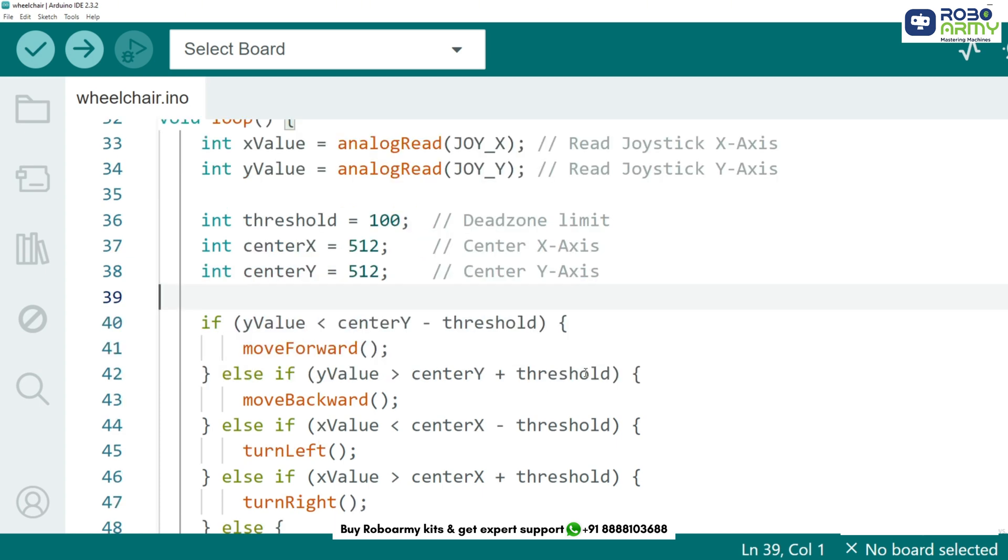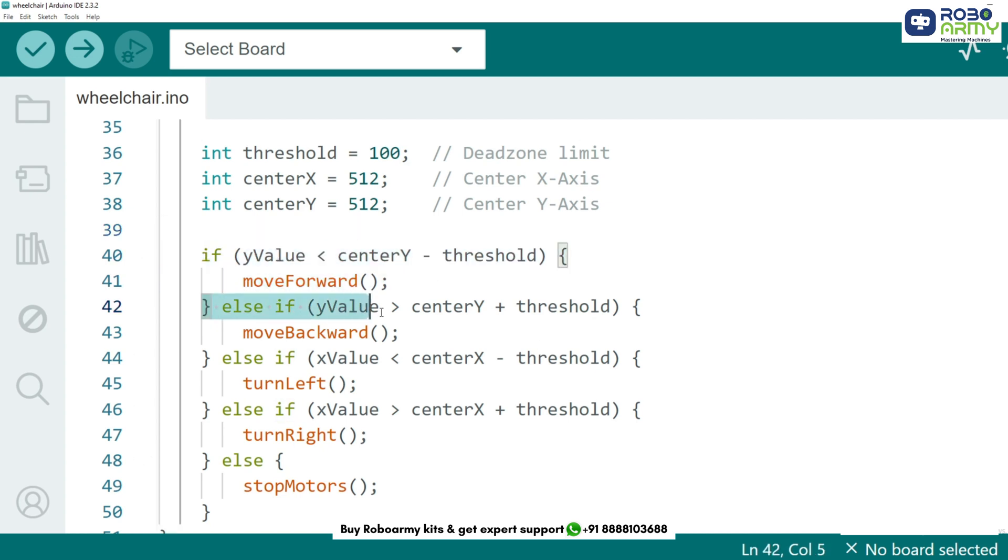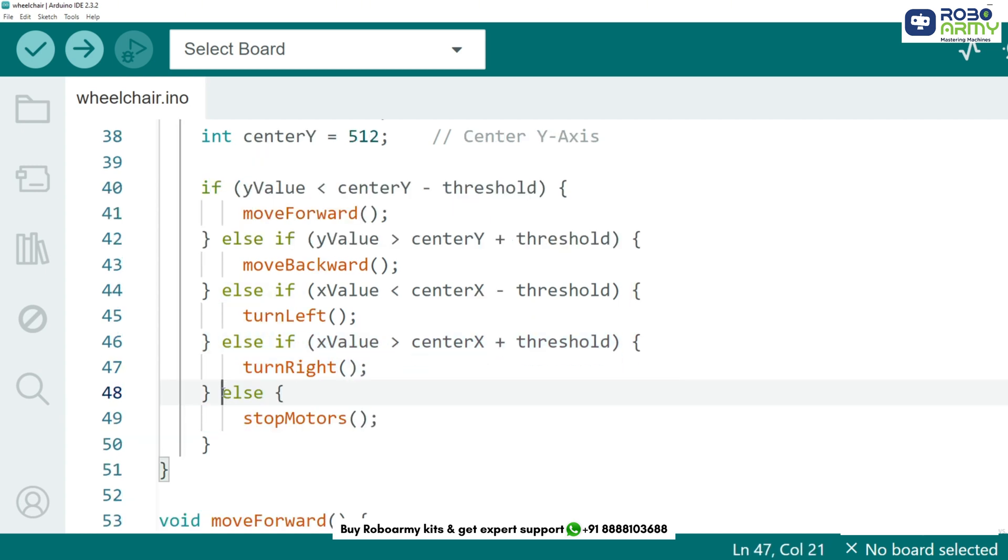Now we check the joystick position and control the motors accordingly. Forward movement, joystick up. Backward movement, joystick down. Turning left, joystick left. Turning right, joystick right. Stopping the motors, joystick center.